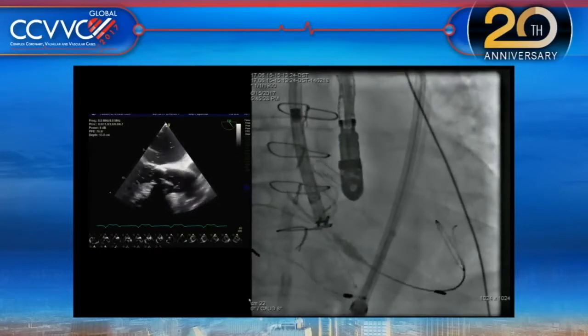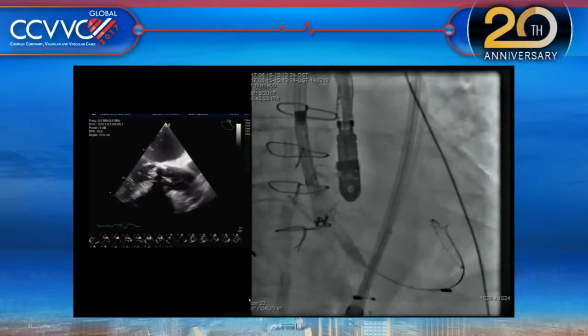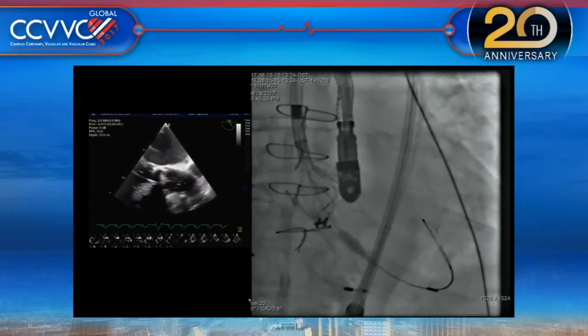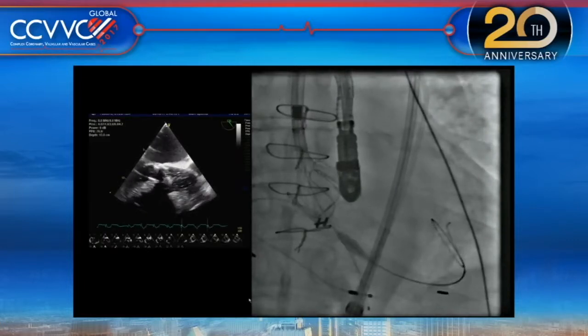As we start to flare, okay, start pacing at 150. Good. Nice, nice. Make sure it stays there. Okay, stop. The pacing is very good. Let's go to the level. The level is very good. Excellent. Stop the pacing.